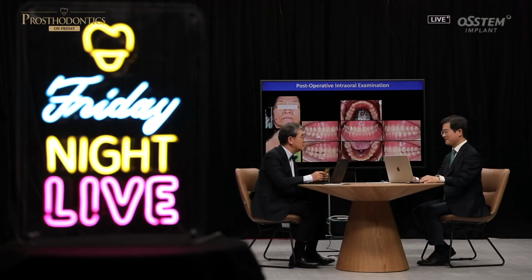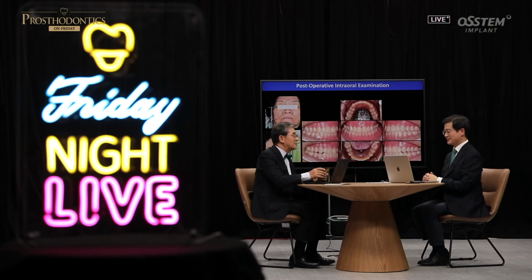So can I ask a question here? Looking at this, it seems that for the edentulous patient, you do an oral scan, but you don't really create the denture with that data. Mostly it seems to be bite registration. You use material for bite registration, so you take it analogically, manually, and the design is then done with the digital system. So you scanned it, right? Using the scan information, can you create a denture from beginning to end?